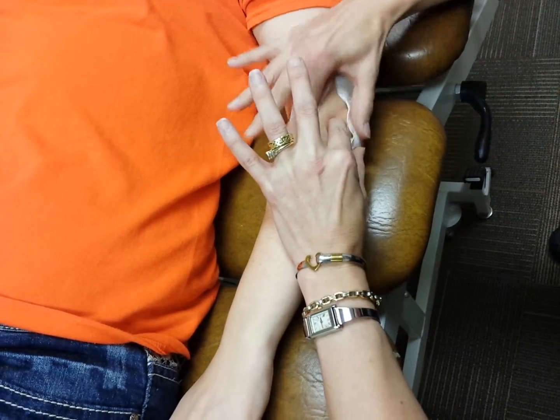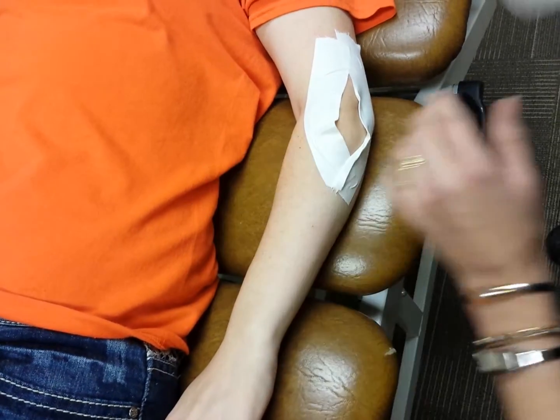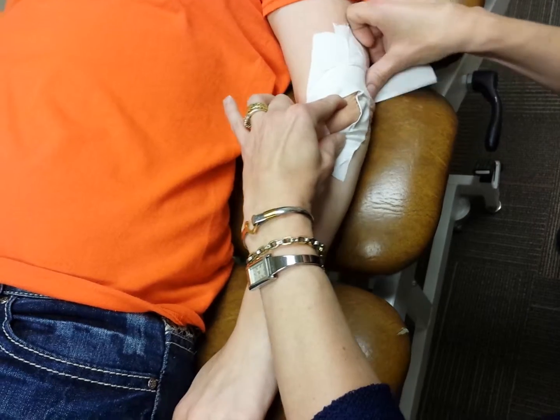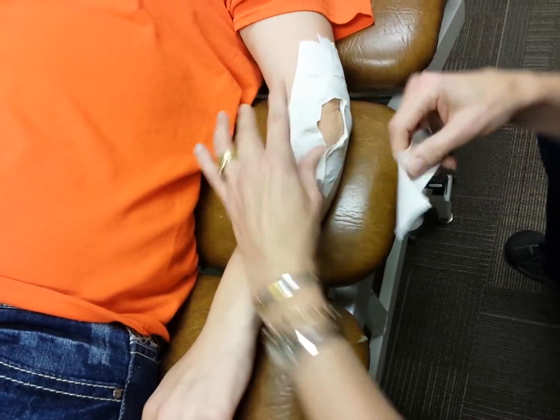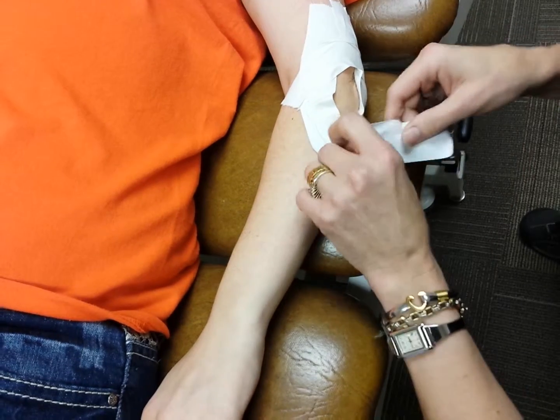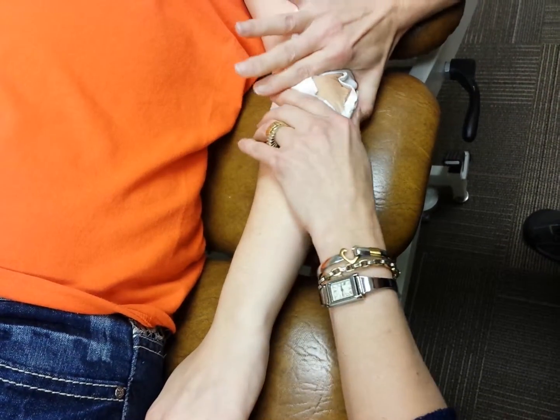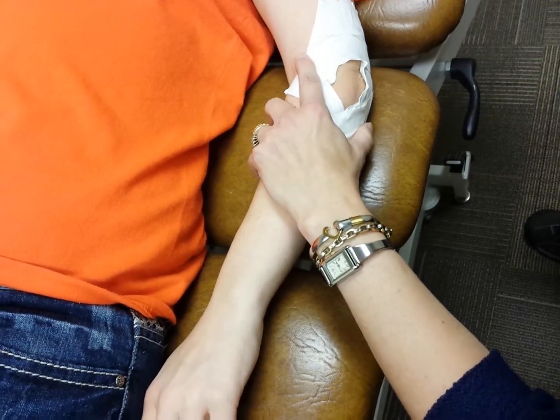You can use a two-tape technique, but I'm going to anchor this in four to create a true diamond. I'm going to come straight across and anchor it down in this direction, then anchor it down from the opposite back side, anchoring up and securing that tape down. This keeps creating a greater puckering — that kind of an orange peel look.